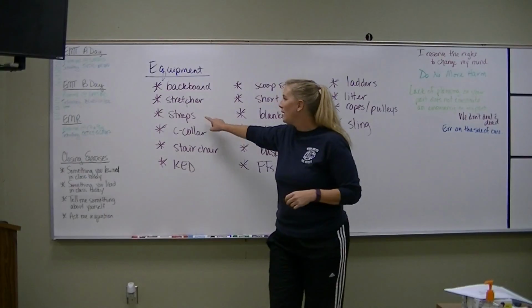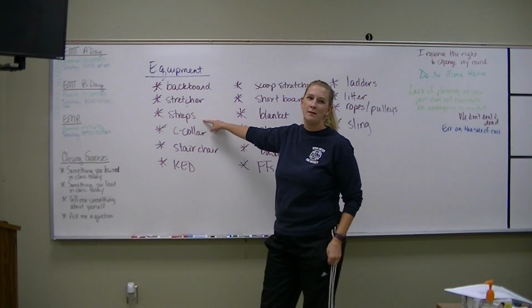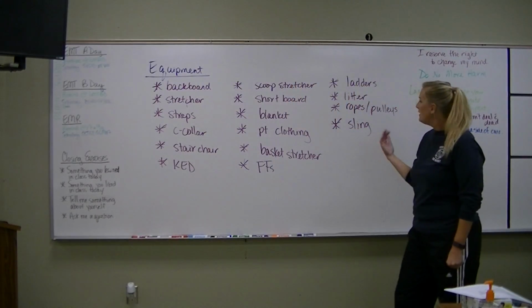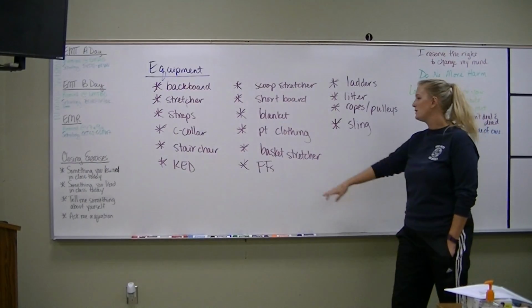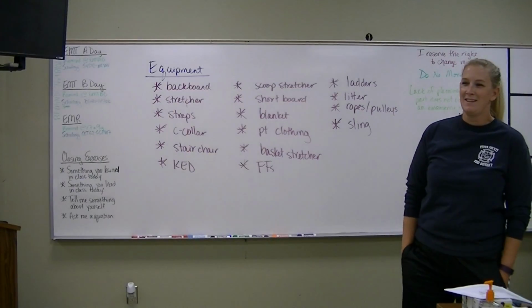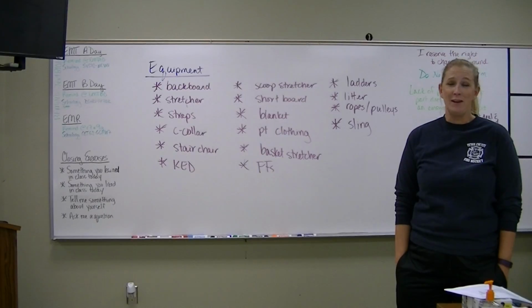Are you going to take them all the way to the hospital? No. Where are you going to put them? On the stretcher. Can you think of any of these that you might use independent of the stretcher? I'm not even using firefighter carries independent of the stretcher. If they're putting my patient on the stretcher on their backboard, they can do the lifting on the stretcher too.